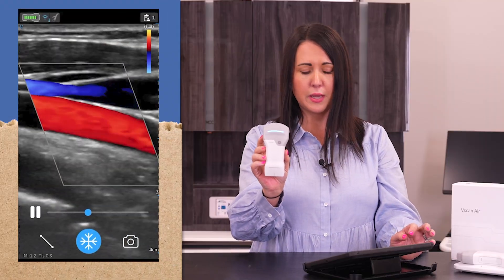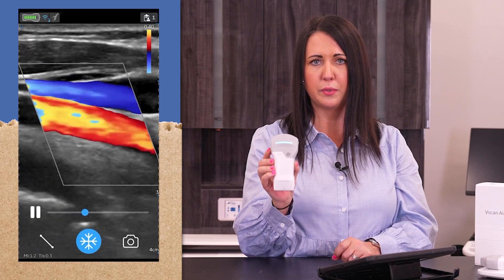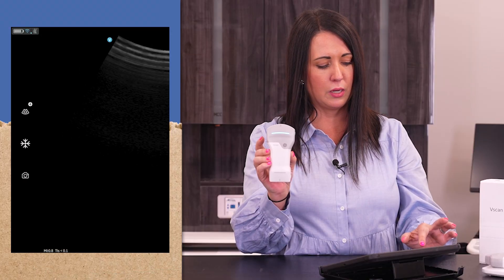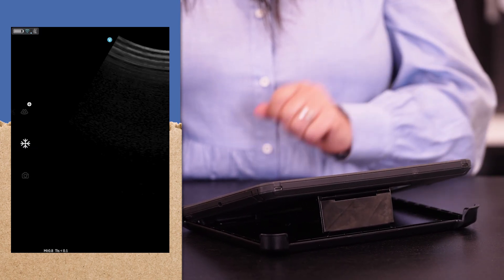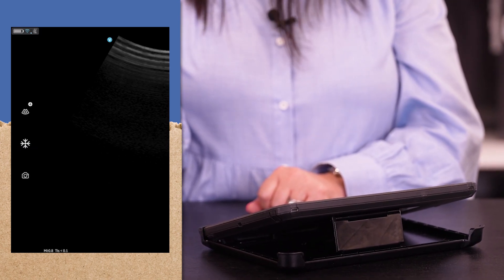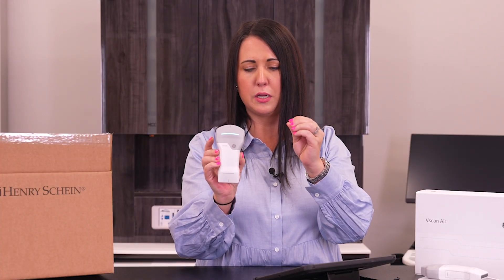There is color on this as well, so you can look at blood flow when you're doing needle guidance — this is a great feature to have turned on so you know where you're going. To take an image capture, you can push the snowflake button to freeze your image and click the camera button to capture, or you can take a cine loop, which is just a few-second video. If you wanted to see the injection and the actual medicine going into the body, you can turn that on and it'll take that cine loop for you.